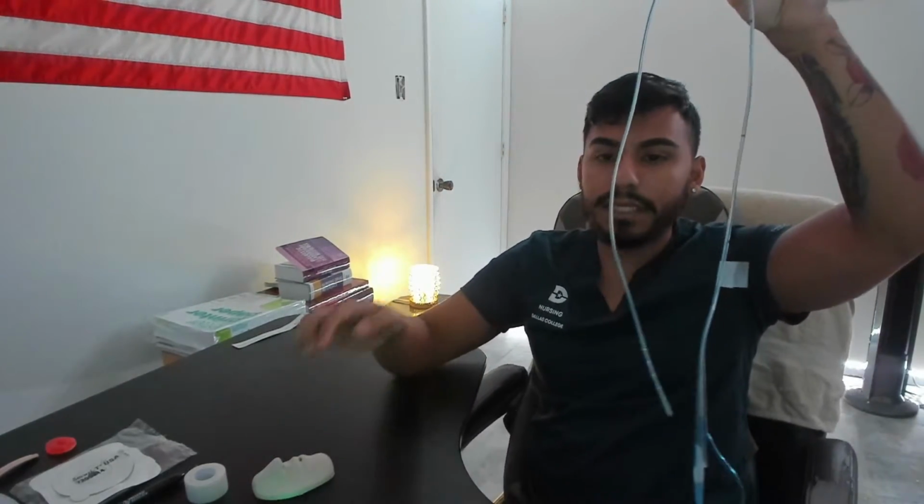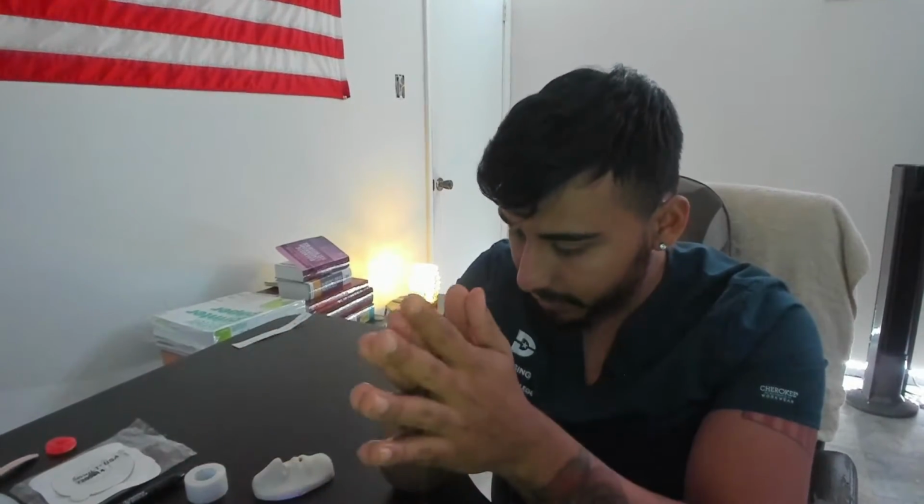I immediately dispose of the tube, dispose of my gloves, perform hand hygiene, and put new gloves on. I want to provide mouth care to Mr. Buzzard, with drinking water, because it's allowed. He's not NPO.